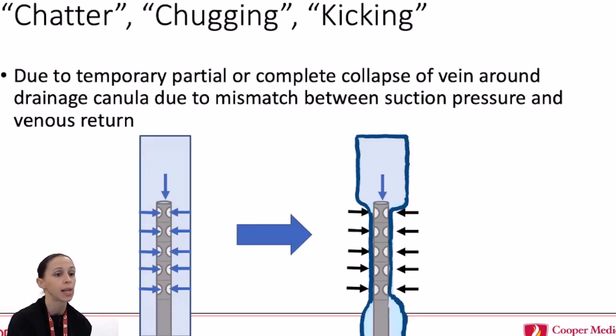Patients that are more susceptible to this: the diuresed patient, the hemorrhaging patient. If you think about the variation in size of the patients we put on, not everyone has the same caliber veins. So we actually measure those when we think about cannula size. We've put some very small women on ECMO. I say women in general because they tend to have a smaller habitus. Their walls are going to be closer to these drainage ports that then can cause collapse.